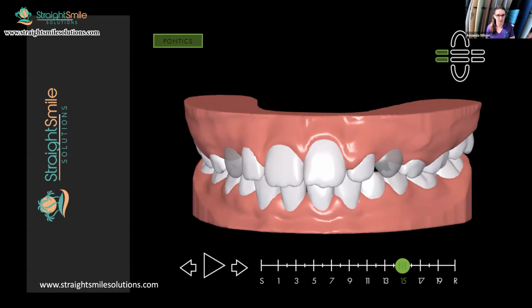This is actually my daughter's phase one case. This is the finish, just to do space consolidation. She has an impacted canine. We just wanted to smush up 7 through 10 so that the canine had a chance to come down. We did it with ClearCorrect without attachments because it has a nice high trim line, super easy, about 19 aligners. Just lining up those front teeth and expanding the arches, really easy stuff, but you can totally do it and it's not expensive.